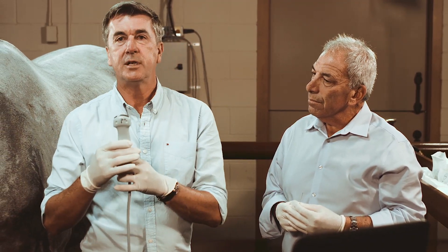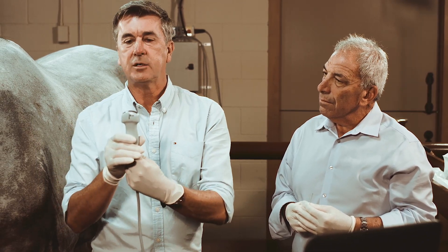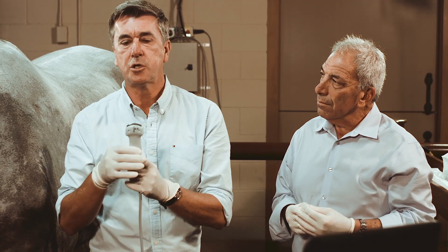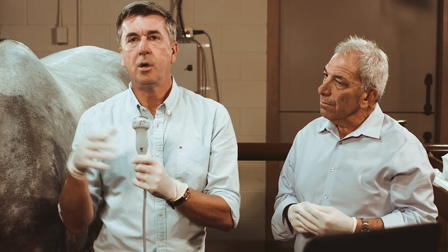This is a probe which has been completely sterilized because these probes are sealed. We are going to use a convex probe which is a three to eight megahertz. So we're going to have a pretty nice view of the superficial structure, but also try to follow the needle as deep as possible where we are putting to inject either a joint or a ligament.